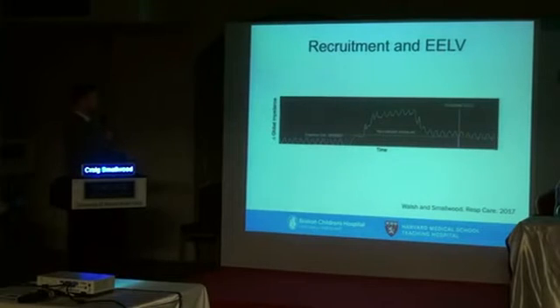So you can see here we have baseline ventilation, and honestly this scale really isn't even that important. You could have arbitrary units, it doesn't exactly matter. But what's important is you have baseline ventilation here, so after the patient exhales, there's going to be a global impedance value that's associated with that baseline. They breathe in, impedance increases, keep breathing, and that's basically baseline ventilation. What happens now, at this time point, the clinician decides to increase the end expiratory pressure, basically a surrogate for a recruitment maneuver, and what we want to see is exactly what they're showing here. We have a marked increase in the pressures, and we're going to see a marked increase in the impedance.